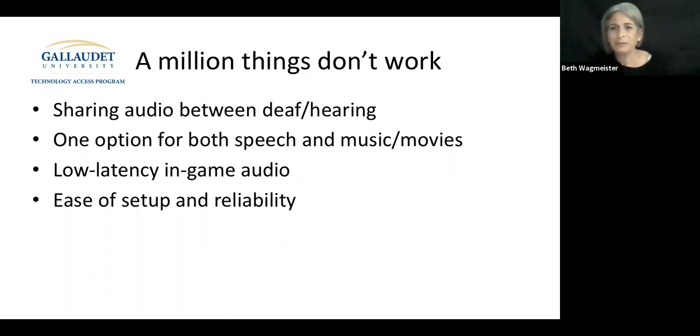Bluetooth, for example, for audio, my kids are listening and their audio and everything, sometimes it doesn't get a signal. It's all set up on the TV. So for technology and assisted listening devices for the TV, so the kids could hear at the same time, and I'm trying to be able to focus on the TV, and the kids are trying to watch TV. It's just a lot happening. So it's trying to figure out how to turn on the audio for both for the kids to hear and for me and my wife to also hear through our assistive listening devices. It's very complicated. It's not easy.